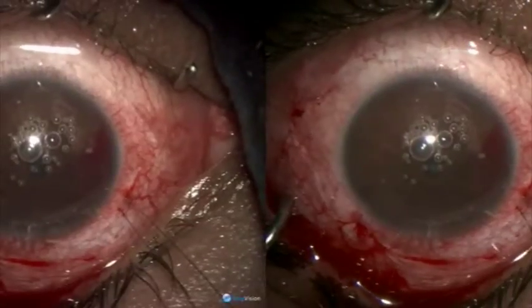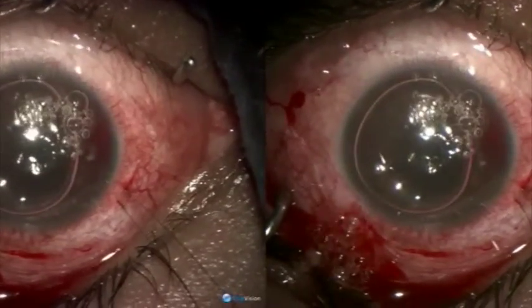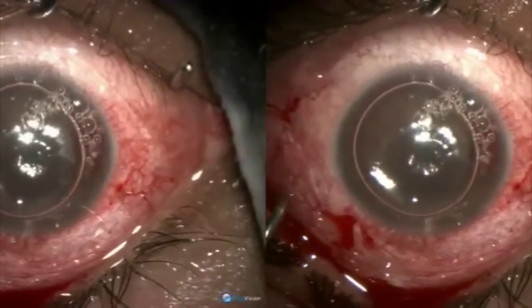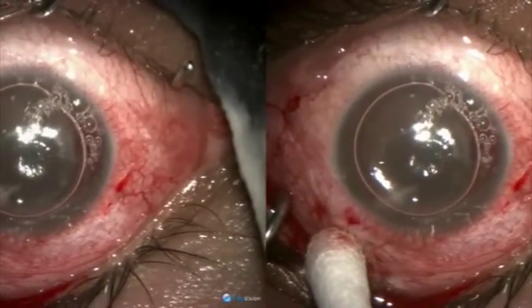And in the end, we inject air into the anterior chamber. That finishes the surgery.